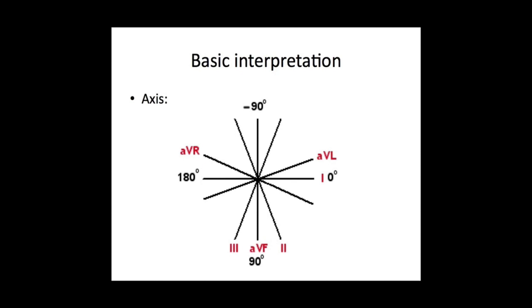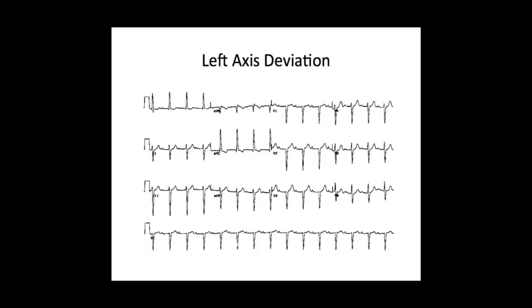To work out whereabouts in these quadrants the axis falls, you need to look at the level of net deflection in leads I and AVF. In this example ECG, the net deflection in lead I is upwards — a positive deflection — whereas for AVF there's a net negative deflection, and the absolute values of the deflection are roughly equal. So the net negative deflection in AVF is roughly equal to the net positive deflection in lead I.